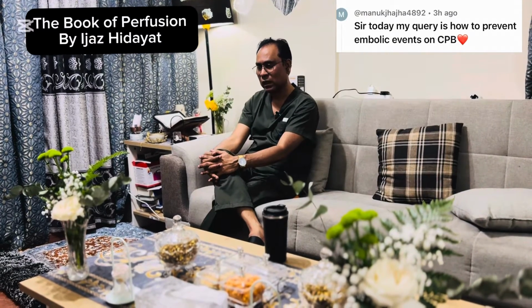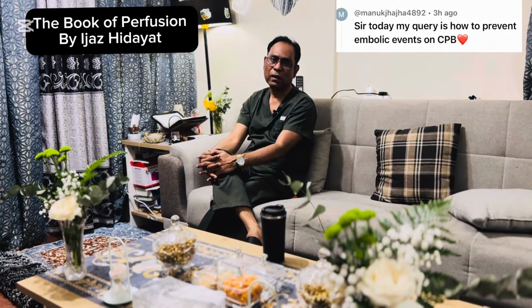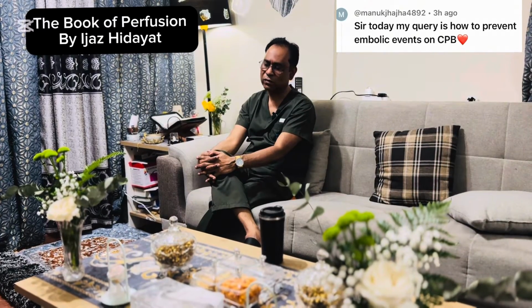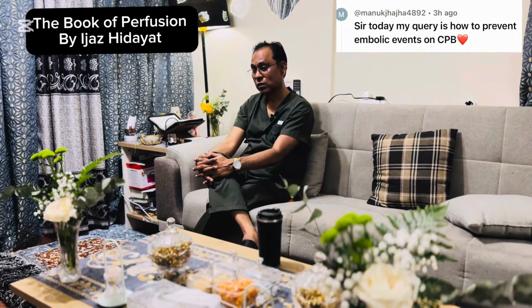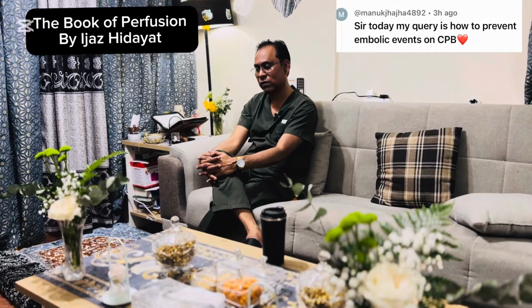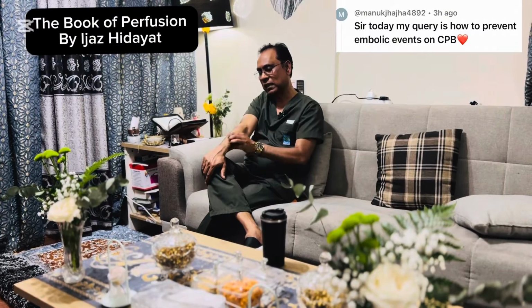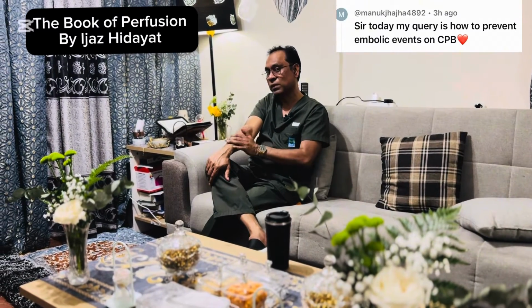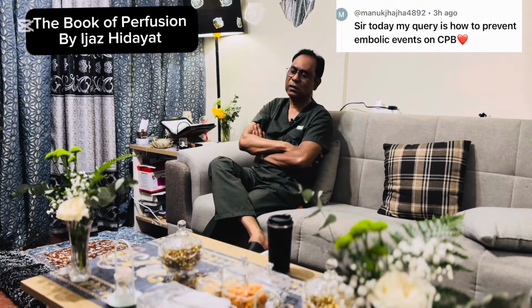First of all, in our extracorporeal circuit, we have a level sensor which we place on the cardiotomy reservoir. It helps us maintain the level of volume in the reservoir in case your volume is decreasing and you're losing volume. The machine will alarm you with a soft alarm that the flow is compromised, and secondly there is an intervention where the machine stops. So one safety measure is the level sensor.